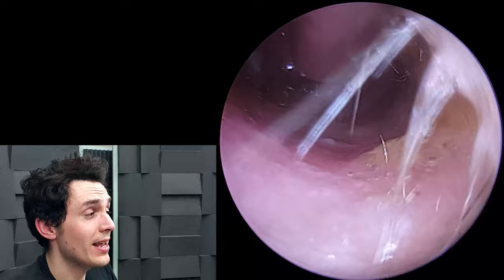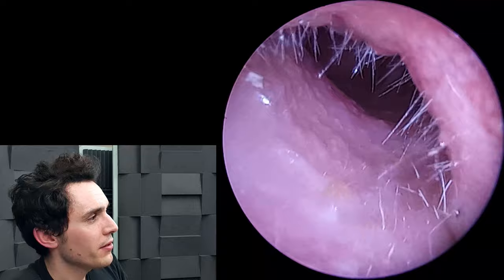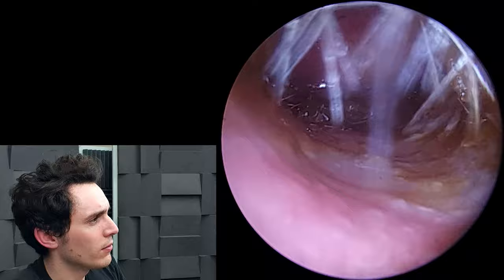The machine is cranked up at this point to around minus 500 millimetres of mercury, so it's fairly powerful suction — I'll show you that in a future video. But nothing is really working to loosen this up, so I've applied some more olive oil.